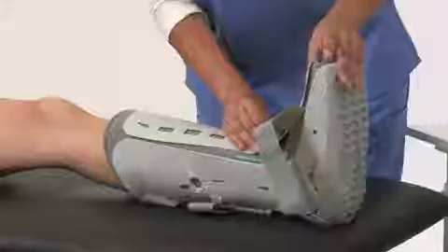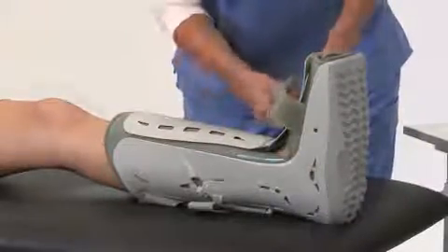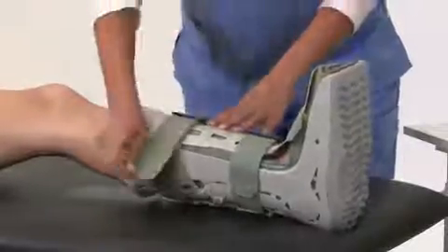Finally, replace the front panel and secure the straps from bottom to top. Tighten them so they are snug and comfortable.